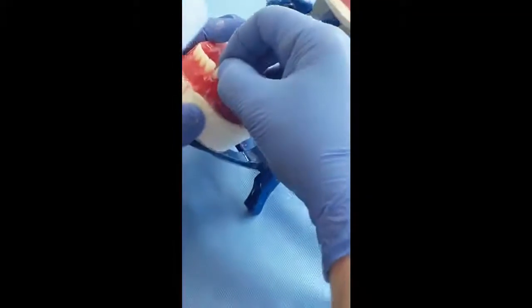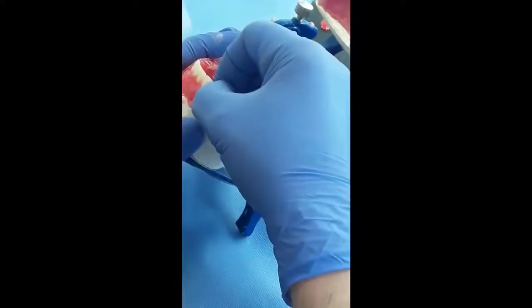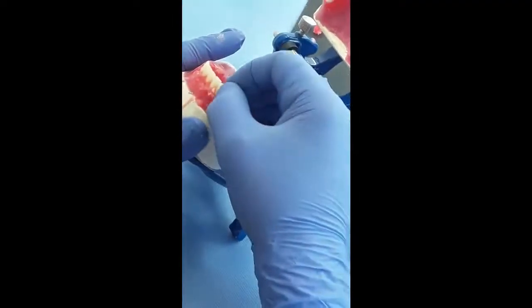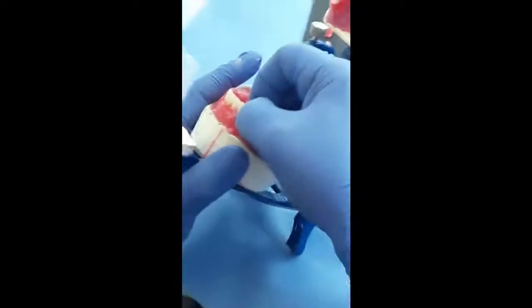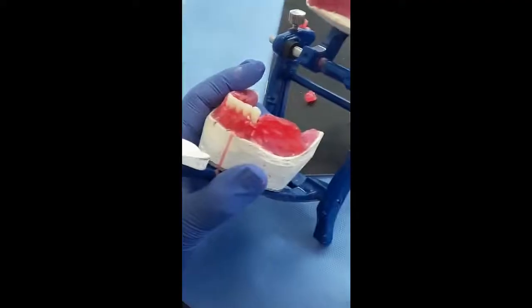Take the canine and put it in the proper angulation from the very beginning. The tip of the canine will conform to the established occlusal plane, or established horizontal plane, by the incisal edges of the centrals and laterals.